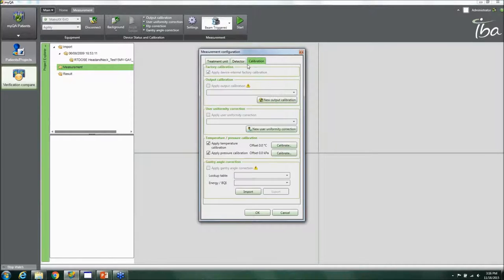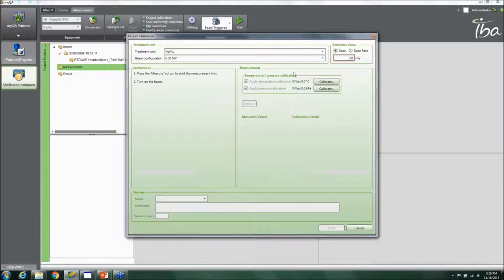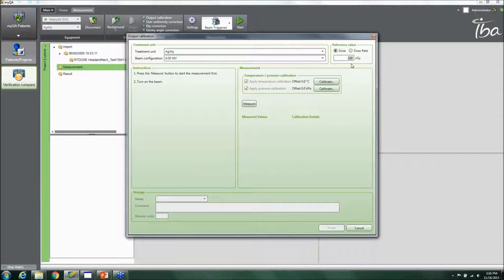In the build-up material and calibration tab, you can apply an output calibration very easily. You click New Output Calibration, specify which LINAC and energy you're on, and enter the known dose — for example, you might deliver 100 monitor units and the calculated dose might be something like 94 cGy depending on how much build-up material you have.